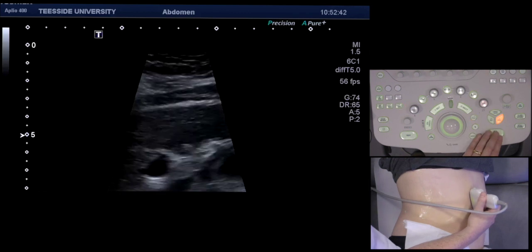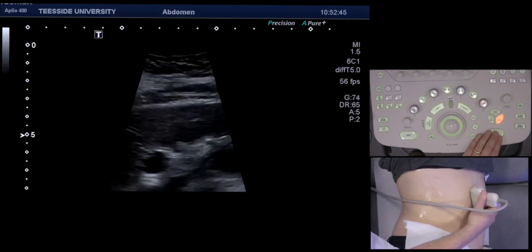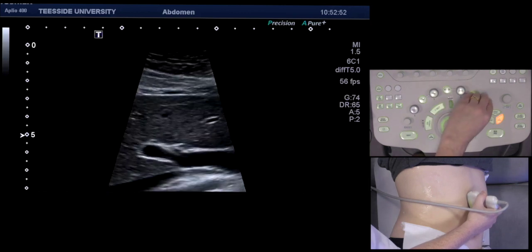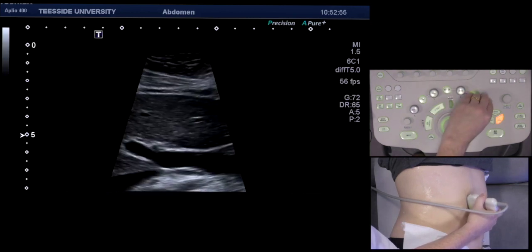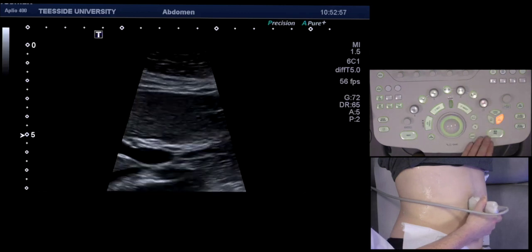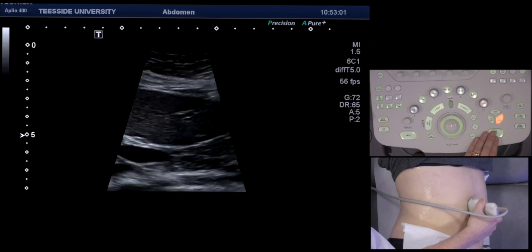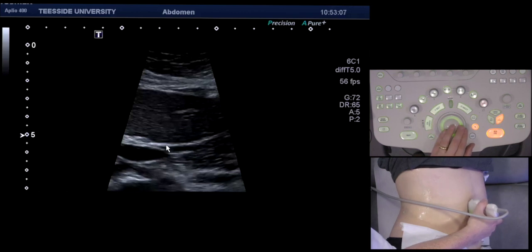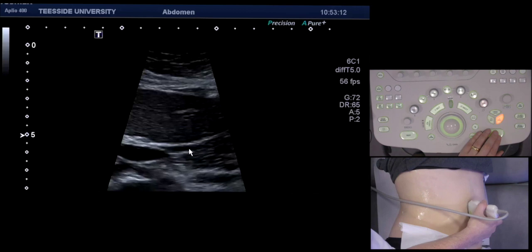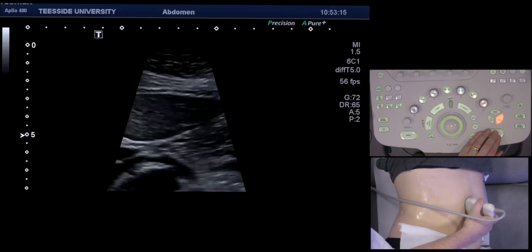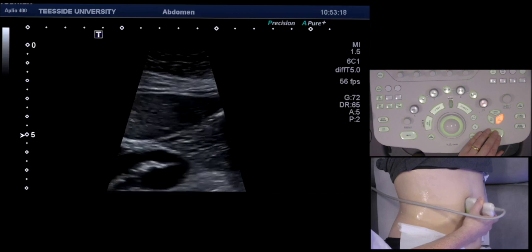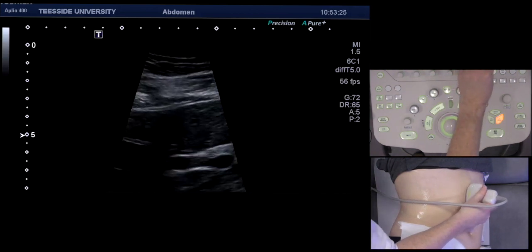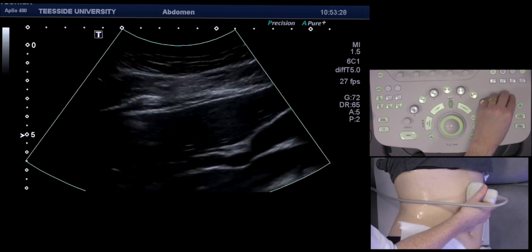As we said, the normal CBD is six millimeters or one millimeter per decade of her life. You also have to make sure that, if possible, you follow the CBD all the way to the head of the pancreas, as we are doing now. There's the CBD running all the way from the portal to the head of the pancreas. That is how I do my gallbladder scans. If necessary, we can also turn the patient decubitus, or stand them up to see if there are any stones with the patient erect.